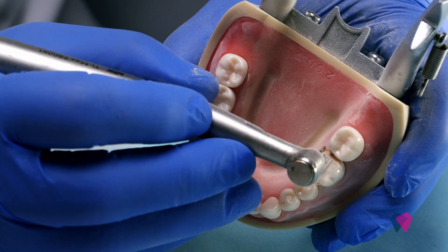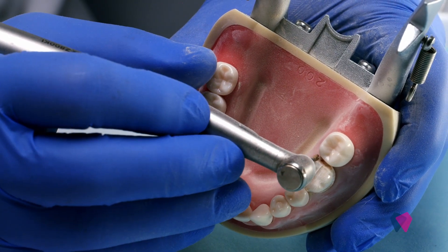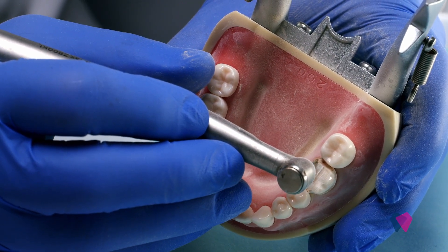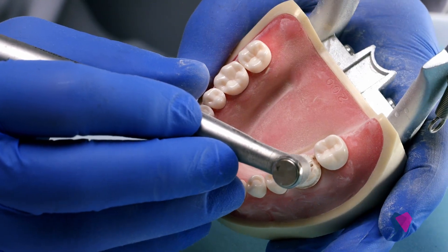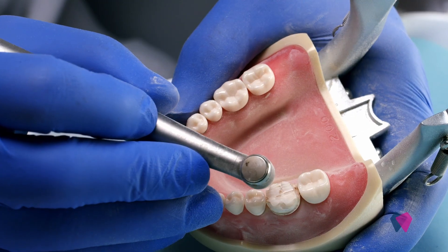I don't know if you can see right in here, but we want to break the contact and make sure that we see some tissue below that opening, so that we know that our material when we take our impression is going to capture that margin and there's a space between the two teeth.